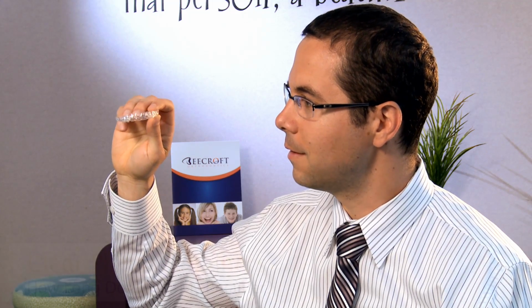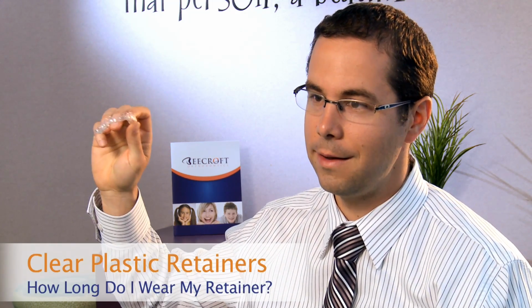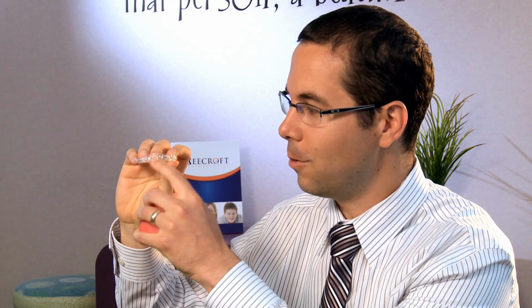So the retainer that we use most often is a clear plastic retainer, and this is a representation of it. And this is really nice for a couple reasons. Number one, there are retainers that have a metal wire that go across the front teeth, and those have their pros and cons, but there's nothing worse than getting your braces off, getting all that metal out of your mouth, and then putting a metal wire in someone's mouth and saying, okay, now you have to wear this full time for a few months. So we use the clear plastic retainer.